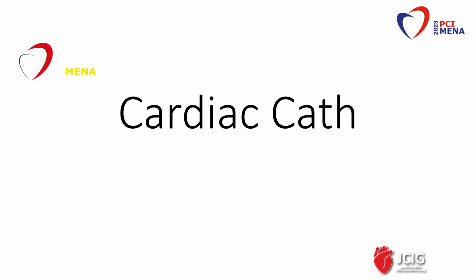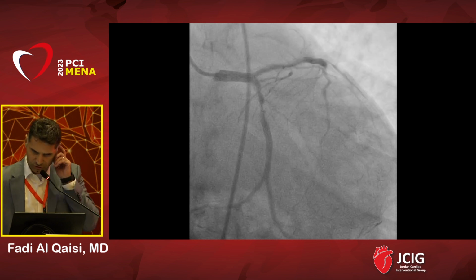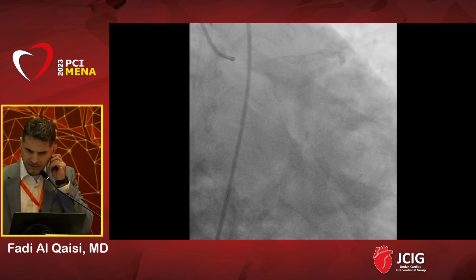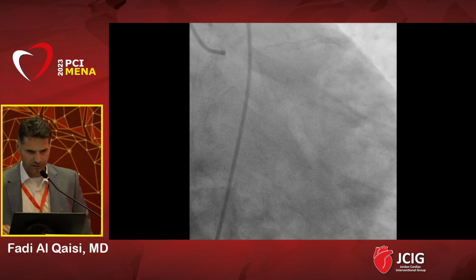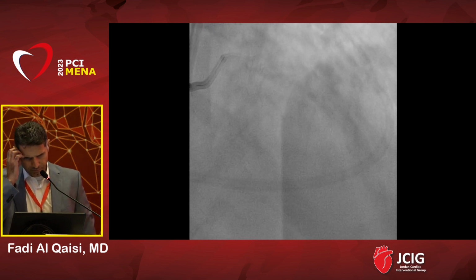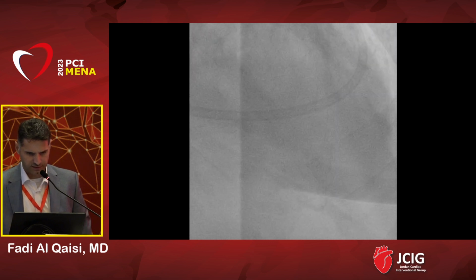She was taken to the cath lab, but before I show you the cath lab of this presentation, let me give you a quick flashback to the cath she had in September. This is her presentation in September that showed normal left main, patent stents in the LAD, severe proximal left circ stenosis that was treated with one stent. Obviously, you can appreciate the distal small vessel disease.